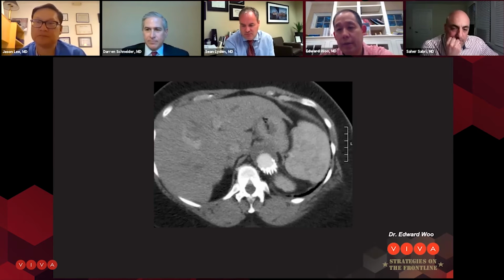And that's a great point. I think if you have a 47 or 46 or 48 total aortic diameter and its minimal true lumen component, I think the Knickerbocker is not going to work. I mean, you could try it, but it's probably not going to work, and you probably need to supplement it with some type of embolization technique like we talked about.